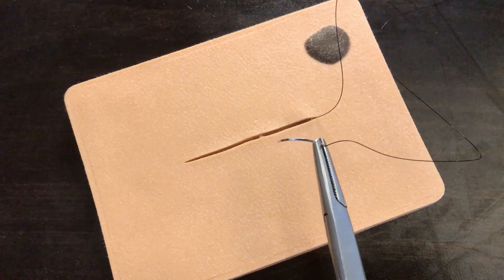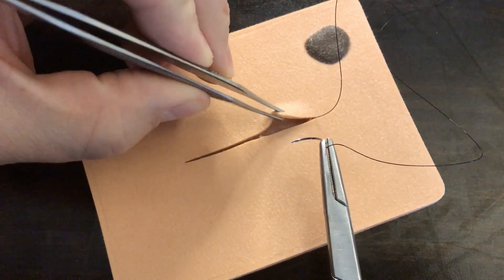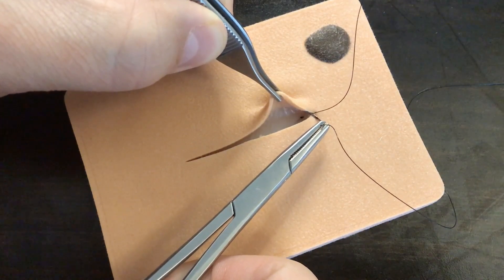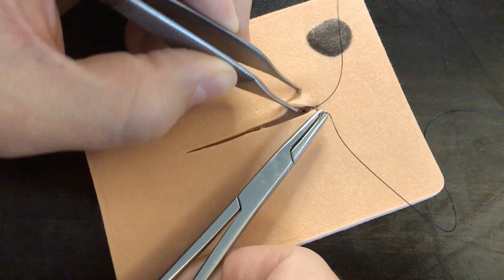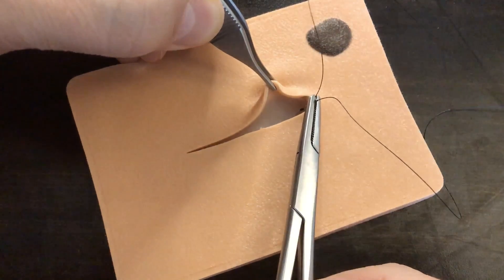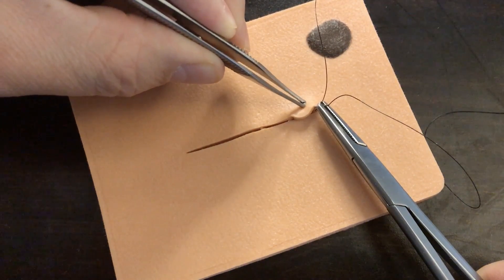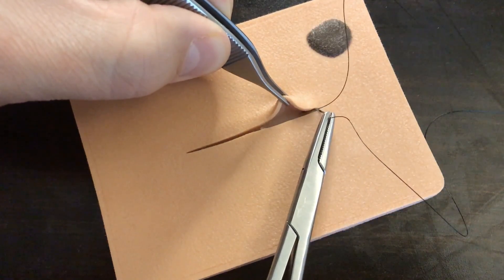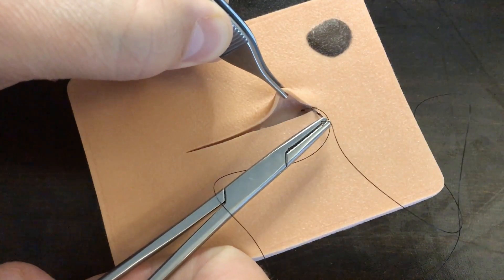So here we go. So next step here is, you're going to want to use your pickups quite a bit with this method because you want to lift up and see the depth of where you're at. And I want to enter the skin just below this skin level, very superficial. And I'm passing through subcutaneous tissue and coming out again, very superficial. And before you pull your needle through, make sure you didn't do what's called buttonhole it where you can see the needle here. Let me show you what a mistake would be.